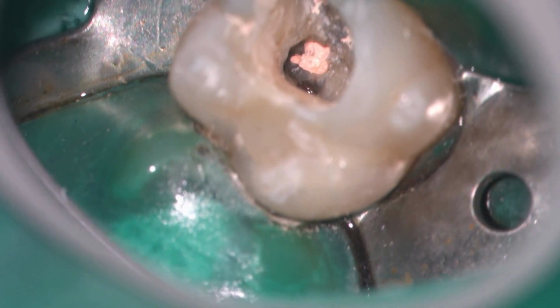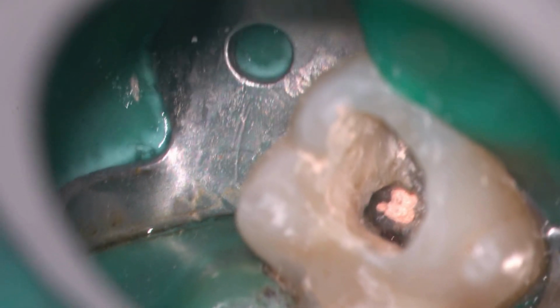We're now mixing the Biodentine in the triturator, and we'll deliver it with an amalgam carrier. Biodentine can have a very interesting consistency, and when you first place it, it may appear dry, but once you touch it and manipulate it, it starts to look more wet. If you vibrate it with an ultrasonic tip, it'll disperse and flow without voids very nicely.